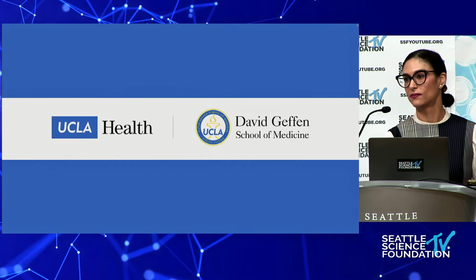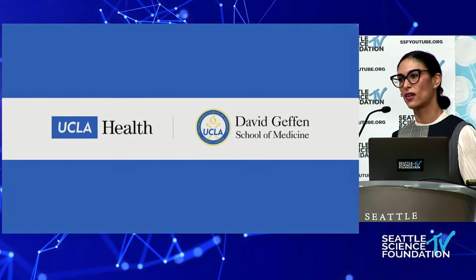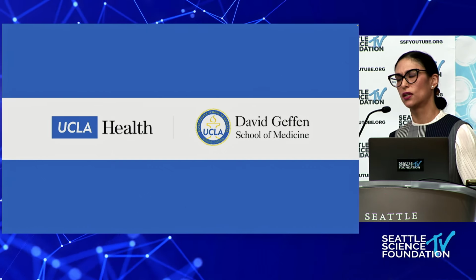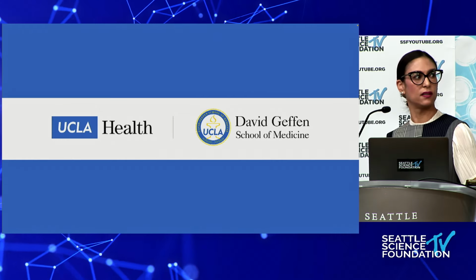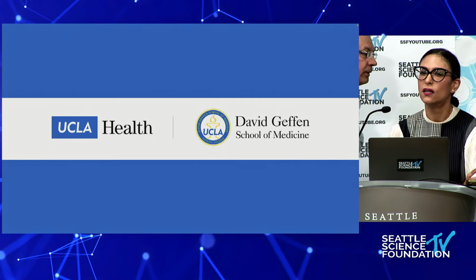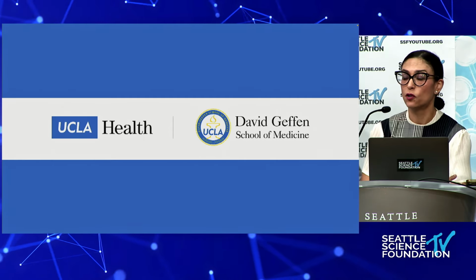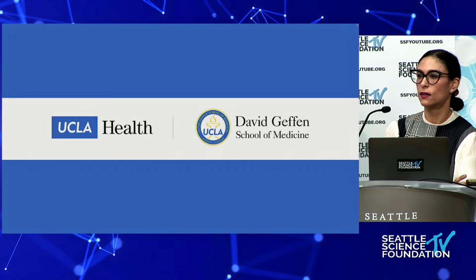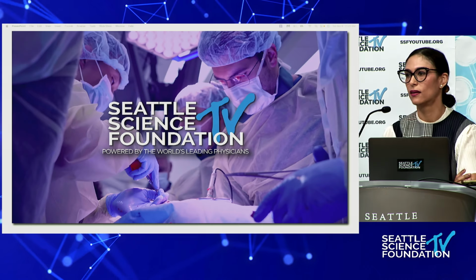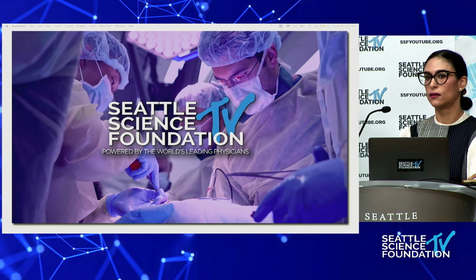Hey, can I ask you a question? I really think about where to put the incisions too, and you were saying the up and down incision. I always make a transverse incision in the back at the little poke holes, just like we do in the cervical spine, and it heals a lot better than going up and down. So I do like a little transverse incision, just like in the cervical spine. For one to pelvis? No, just if I'm doing little poke holes to put the screws in. I think it doesn't make a huge difference, but it kind of helps out.